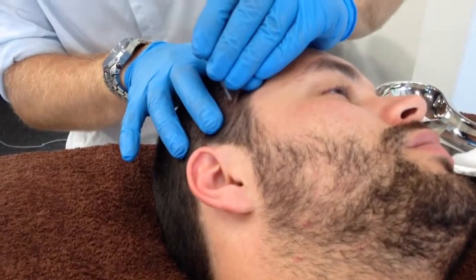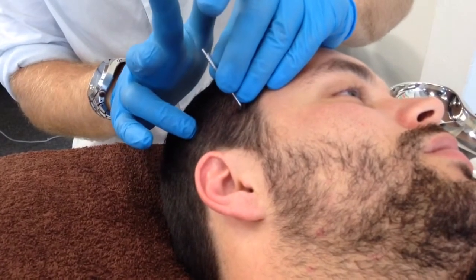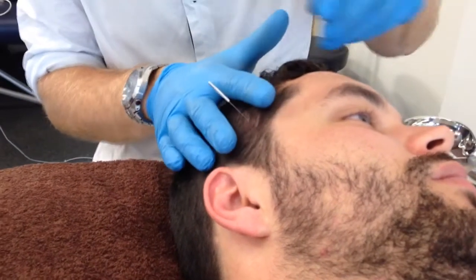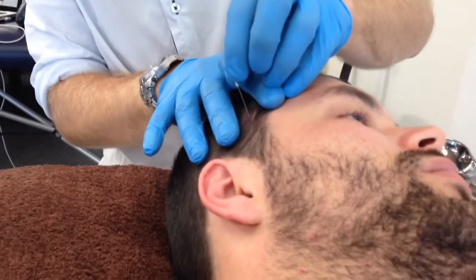Once the area to be needled has been located, the needle should be angled at an oblique caudate angle towards the temporalis fossa.